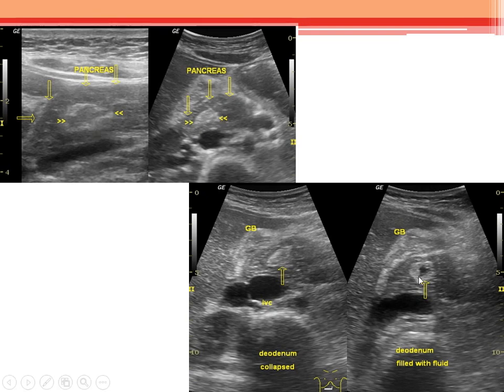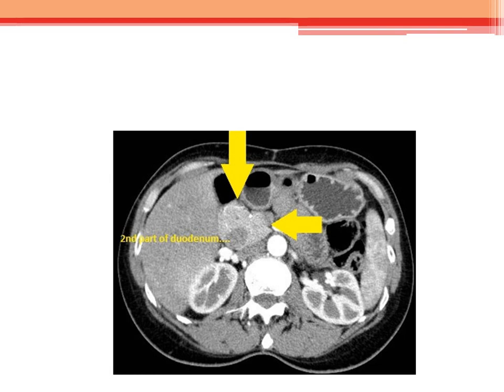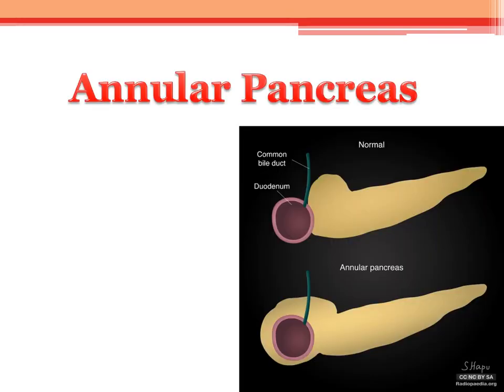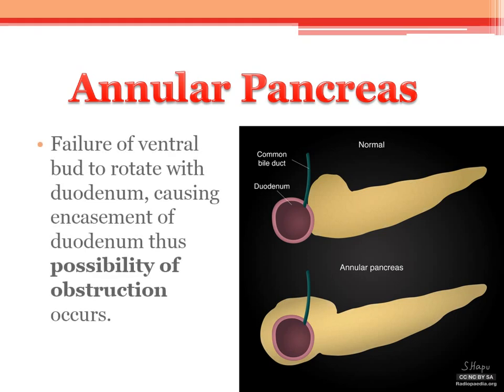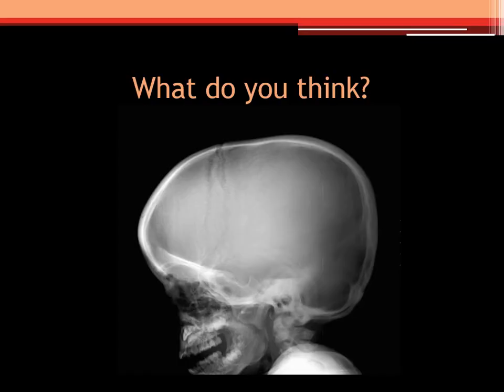Something echogenic inside the pancreas — what could cause this? This is bowel encasement. We traced it upward and backward, and there was intraluminal fluid-like content, suspicious for the duodenum. A CT scan was done and confirmed the diagnosis, though it was already confirmed by ultrasound. This is a case of annular pancreas — the ventral bud fails to rotate with the duodenum, so the duodenum becomes encased by the pancreas.